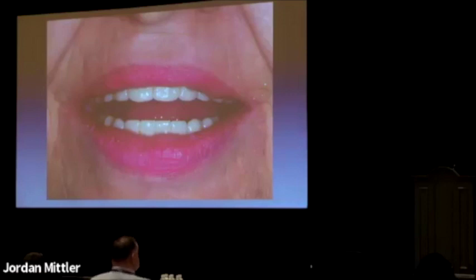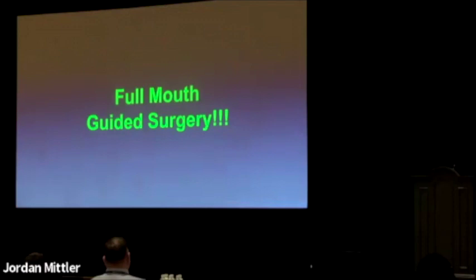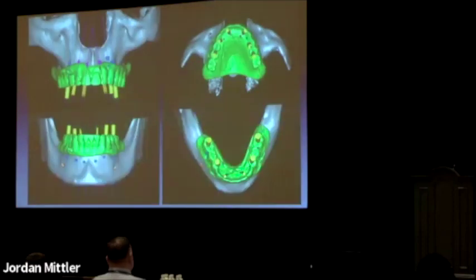This is acrylic, easy to add to, easy to subtract from. And now at least we've got some sort of baseline to try to figure out where things go. And I'm not going to go through all the details here, but we can basically now set up to do a full mouth guided surgery.